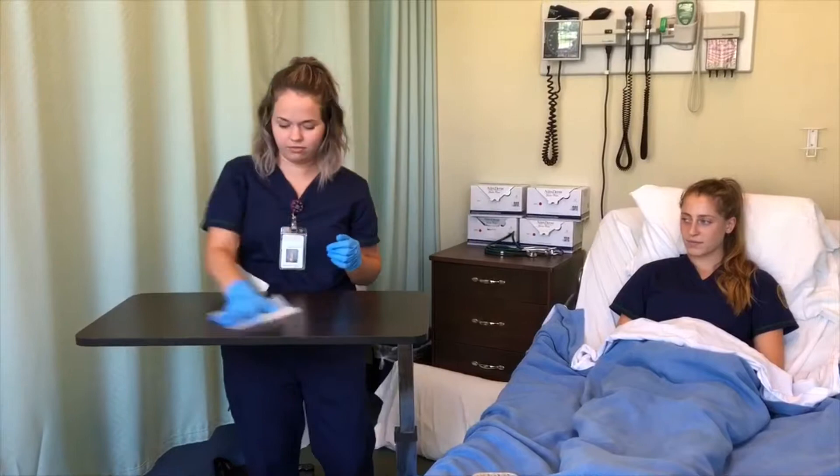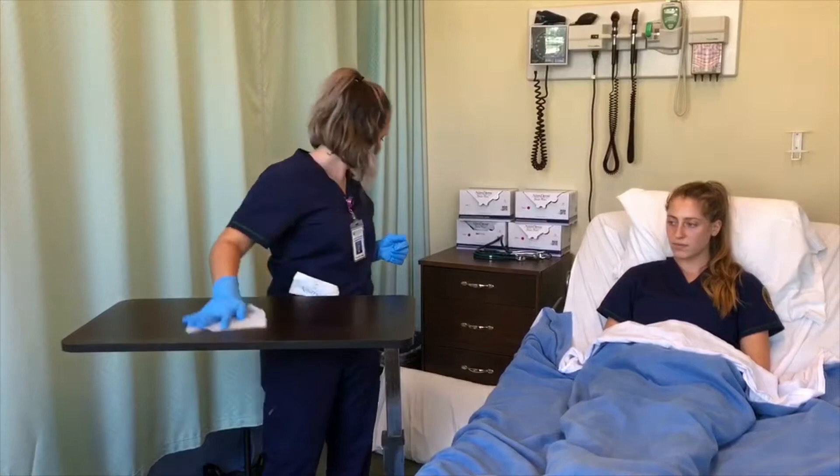Now that the table is wiped off, she is going to wash her hands and apply hand sanitizer before putting on her sterile gloves.